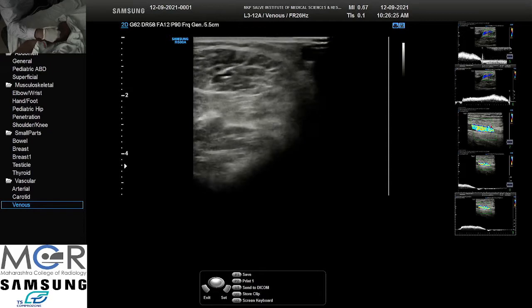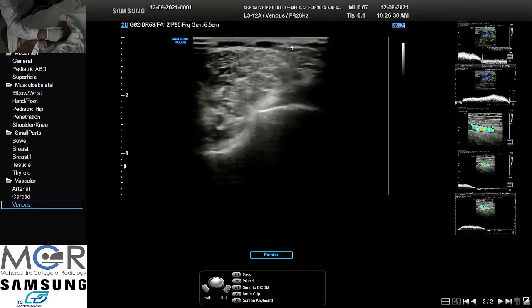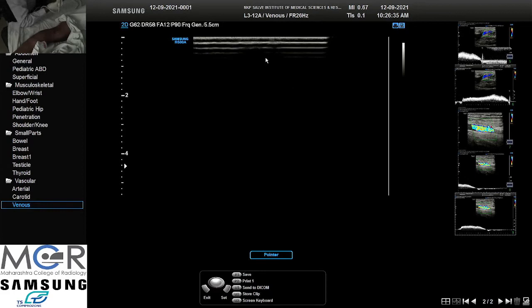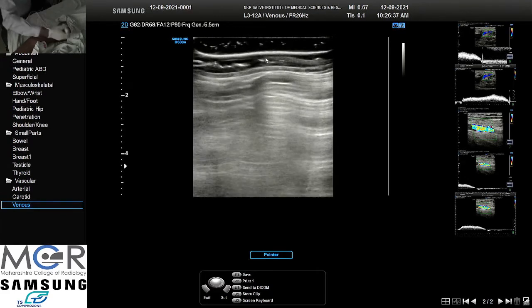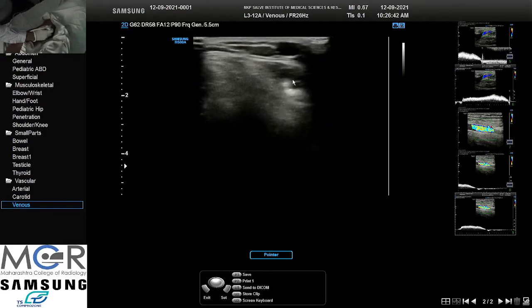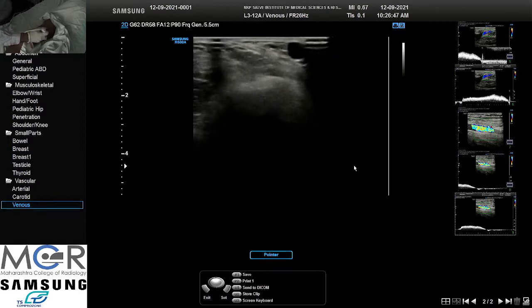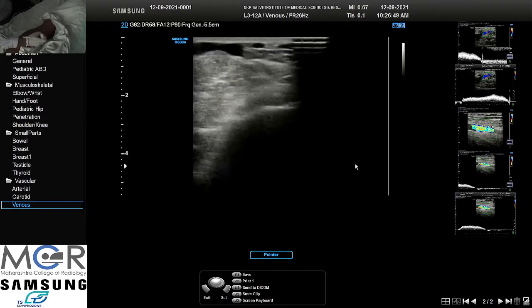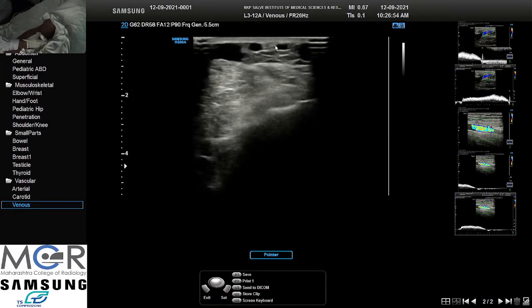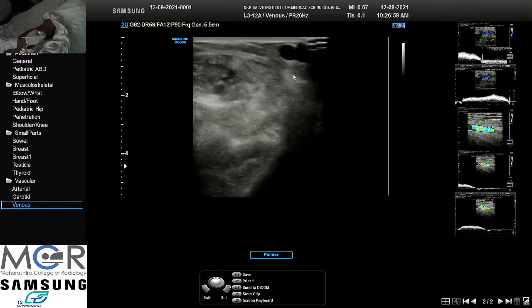So here in the superficial plane you can see that varicosity is at the point of swelling he was pointing to. There are dilated veins here. We'll follow the GSV and try to see whether they are tributaries of the GSV. This is GSV and this is the tributary, and that is producing here superficial varicosities.